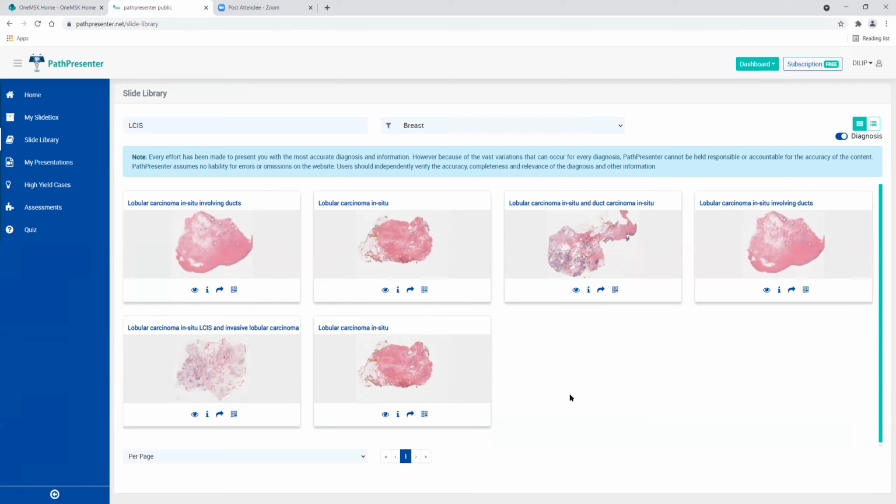So anyway, for now, what is an unusual or special type of LCIS? There are two broad groups. One is what nowadays we call florid LCIS. Previously, for this same thing, people used to say LCIS with marked acinar expansion and central necrosis. That was also the term used for florid LCIS. And then the other, of course, is pleomorphic LCIS.